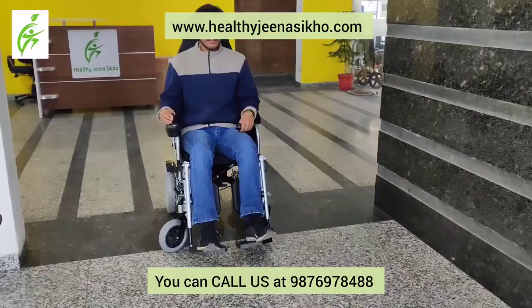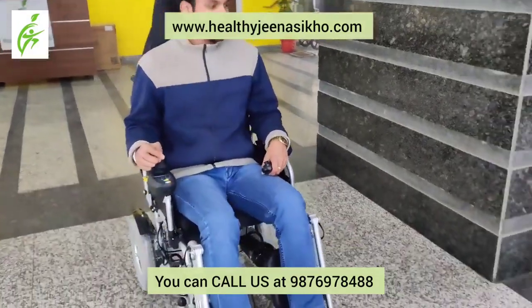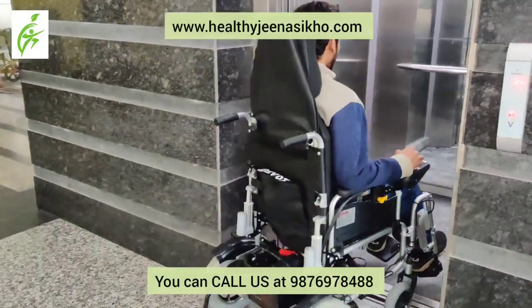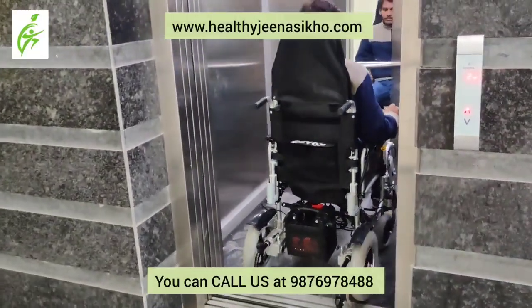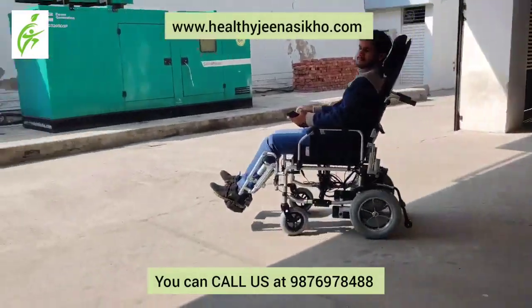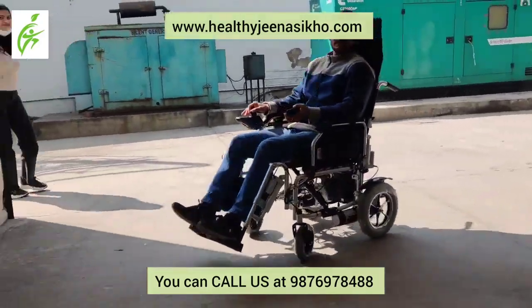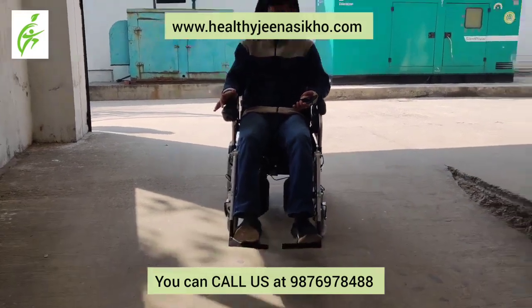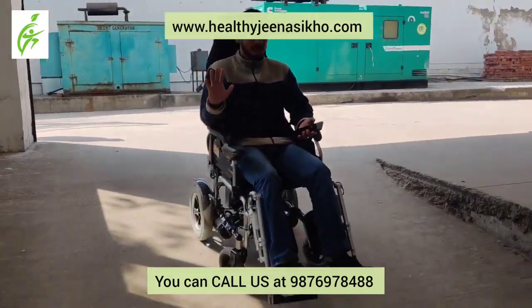You can take it to the office and fit it in a lift if you want. If you want to go to the park, you can use it very easily. This wheelchair is very easy to use. The braking system is incredible.